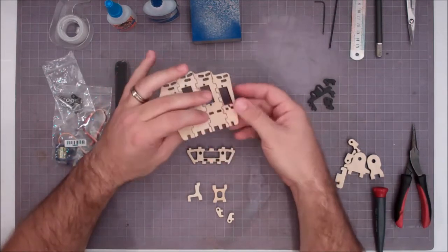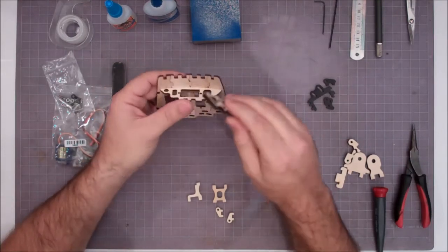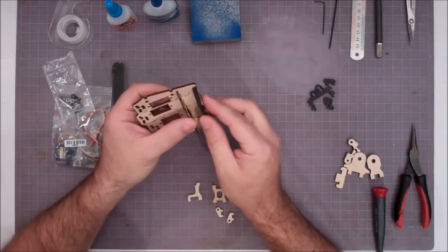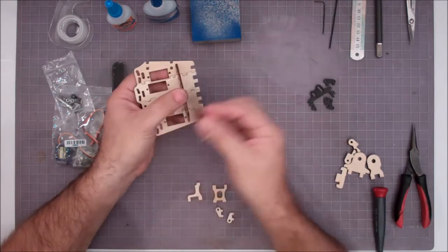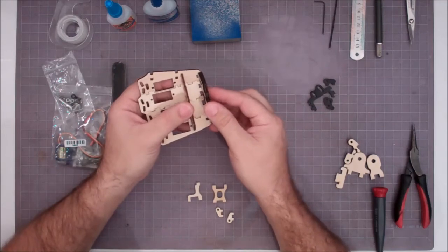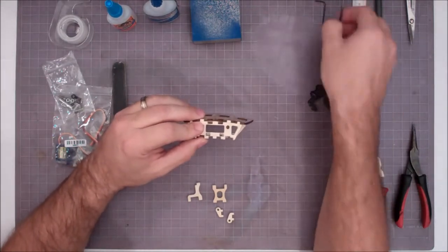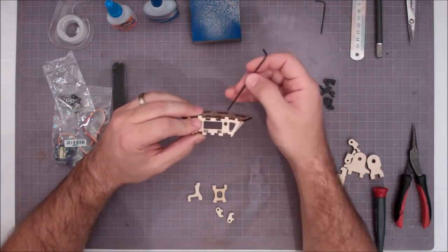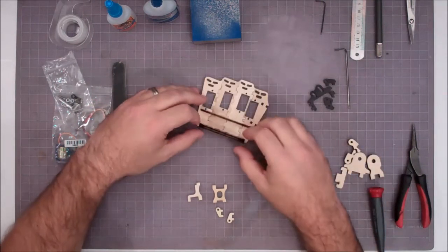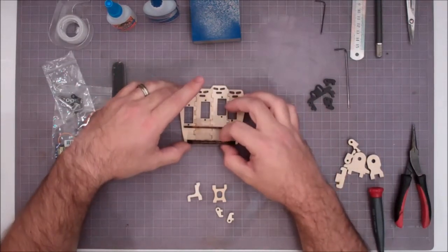Now, next will be your back plate. Again, larger triangle, larger flat goes to the thumb side. Now on this plate, instead of pushing it in from the front, that doesn't really work because the plates are all at an angle. You want to bring this plate in from the back. So you just kind of bring it up where it needs to be, and you just kind of slide it in from the back. And it'll just key down in there. Again, these 2 notches right here, those are for the wrist parts. If you're building just a hand, those will be filled in. Okay? Once you get that plate in there, it's either going to be tight or slightly loose, it doesn't really matter, just as long as it all goes together. We'll glue it all in a minute.